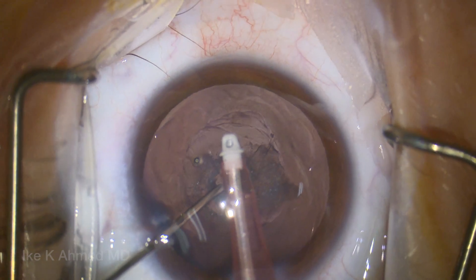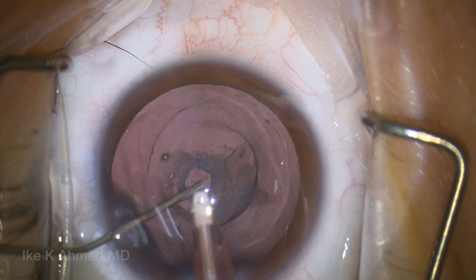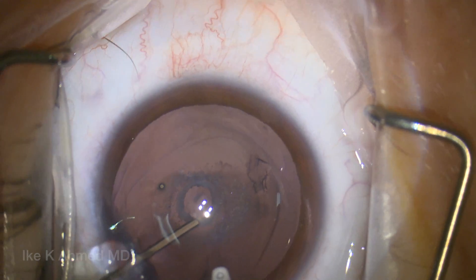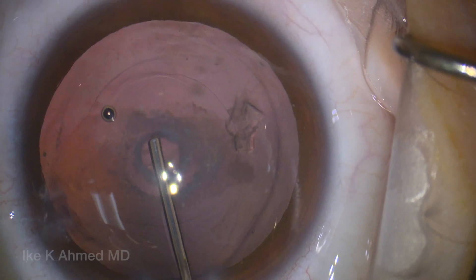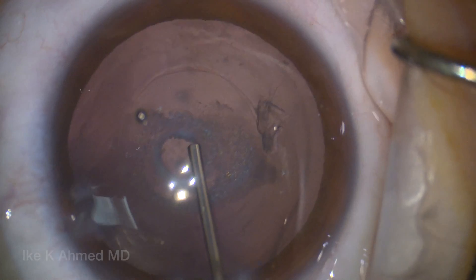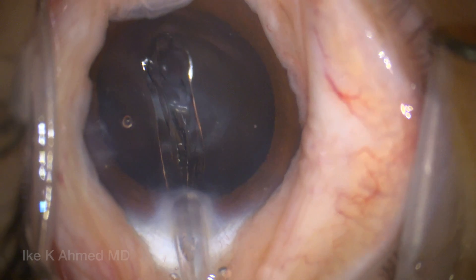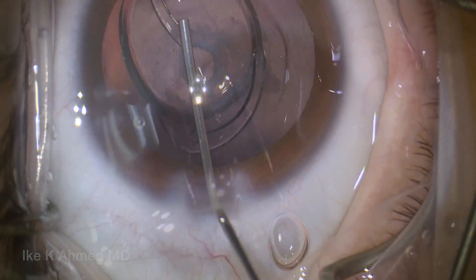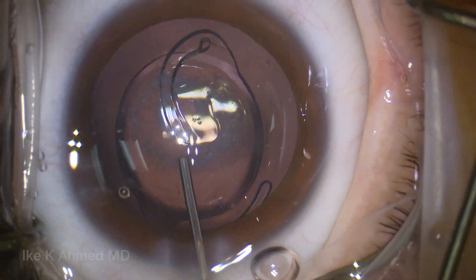We inject some dispersive viscoelastic to provide sequestration of the area, then a cohesive on top to create space, and we can reassess the situation. We come out with the IA handpiece with the chamber well formed to prevent vitreous prolapse. Further injection reveals that the posterior capsule is indeed deficient. In this case, we're going to put a lens in the capsular bag first before tackling the posterior capsule — a one-piece lens with both haptics released and unfolded into the capsular fornix.